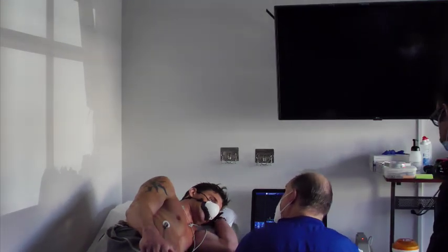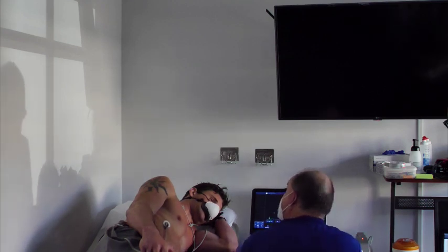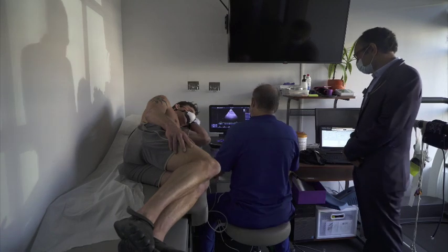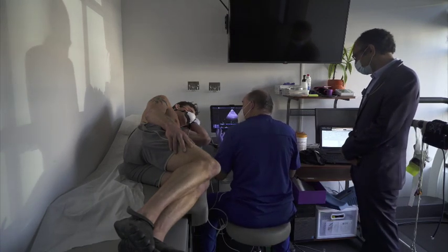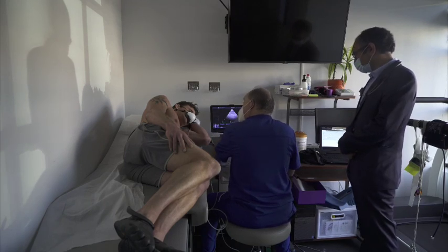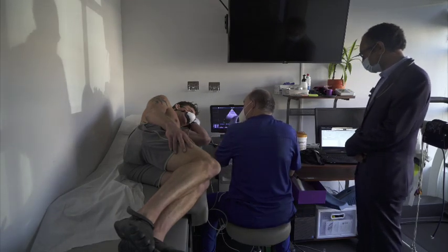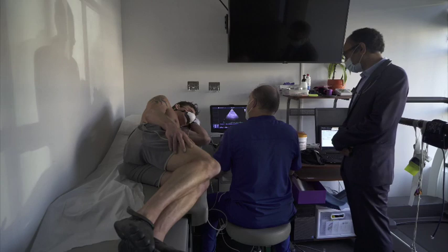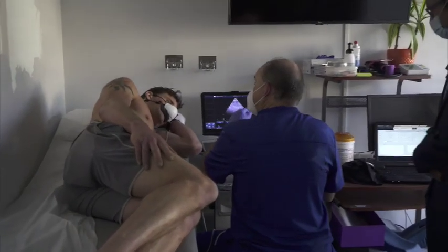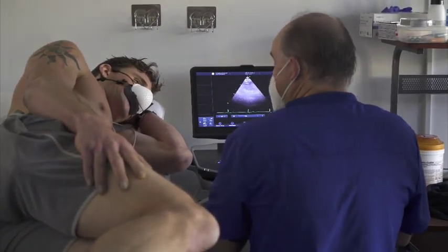So this is an ultrasound — just like when they look at a baby, we're going to be looking at your heart and all the mechanics within it: the valves, the walls, the chambers. We have the ability to turn on color flow, which is a Doppler — like sonar — so we can actually watch the blood flow going through the heart, look at leaky valves, and measure the velocities going through the valves.